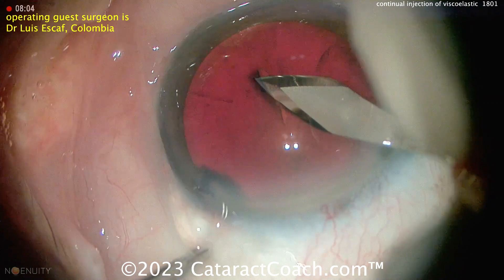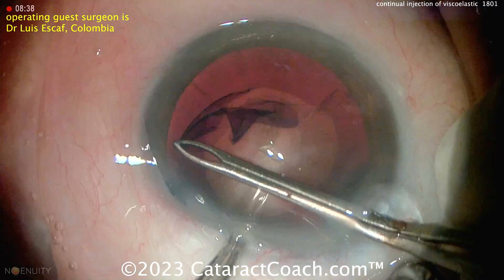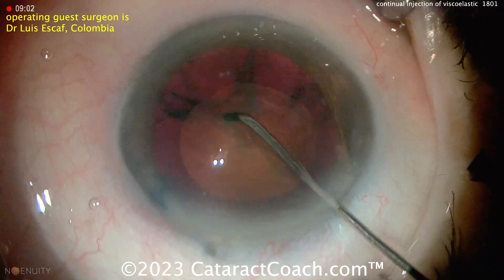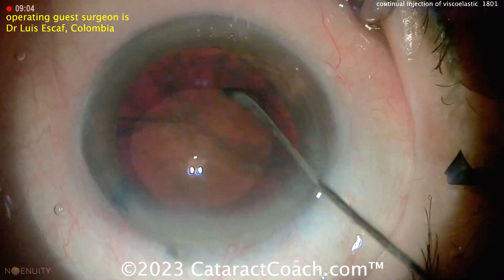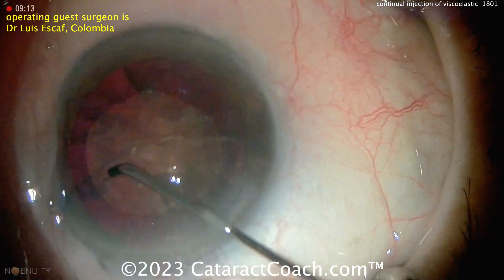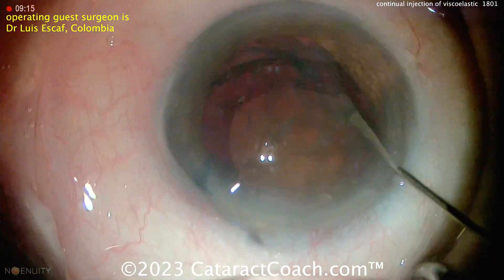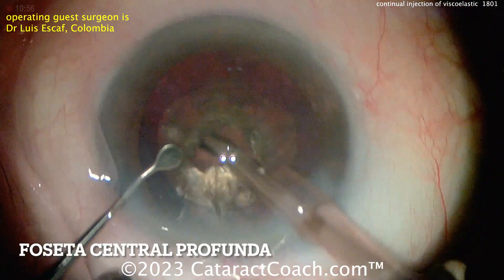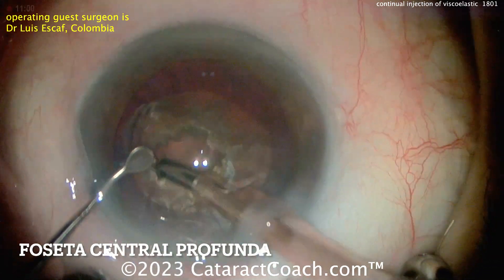We've got a nice dense cataract. And as you know, when we do these dense cataracts, we're worried about too much ultrasonic energy in the endothelium and damaging the cornea, but also worried about that posterior capsule coming up. When you have a dense cataract, there's not a whole lot of cortex to weigh down the capsule bag. Getting it nicely rotated, good hydrodissection done. And now starting off with some phaco here.